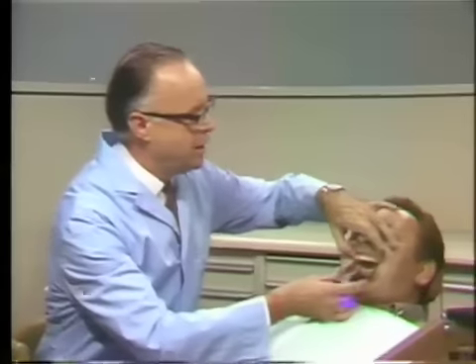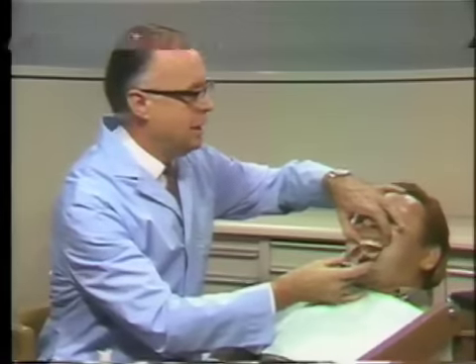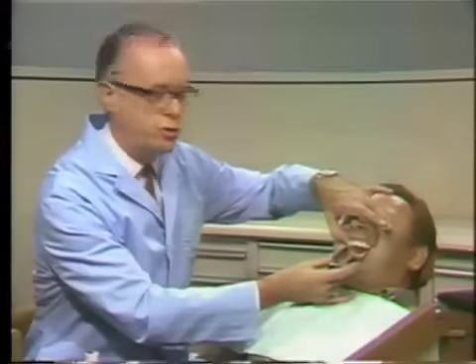Now that we've discussed the long pin facing, let's go and have a look at a clinical case which was recorded earlier. This is the first visit in the construction of an anterior bridge for our patient here, which I think you can see quite nicely from this mirror here. It's replacing the right upper lateral tooth, as you can see.